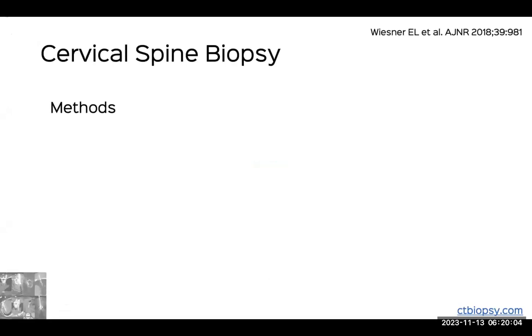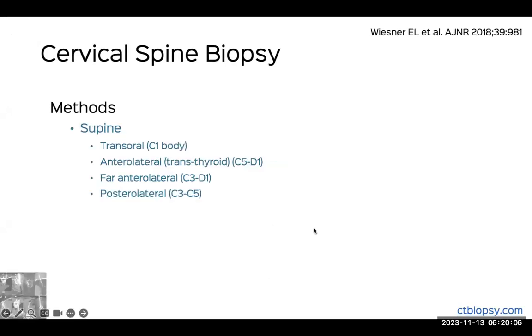You have to be a little creative in the spine. So in the cervical spine, in the supine position, for C1, you might need to go transoral, anterolateral, posterolateral for the other levels.